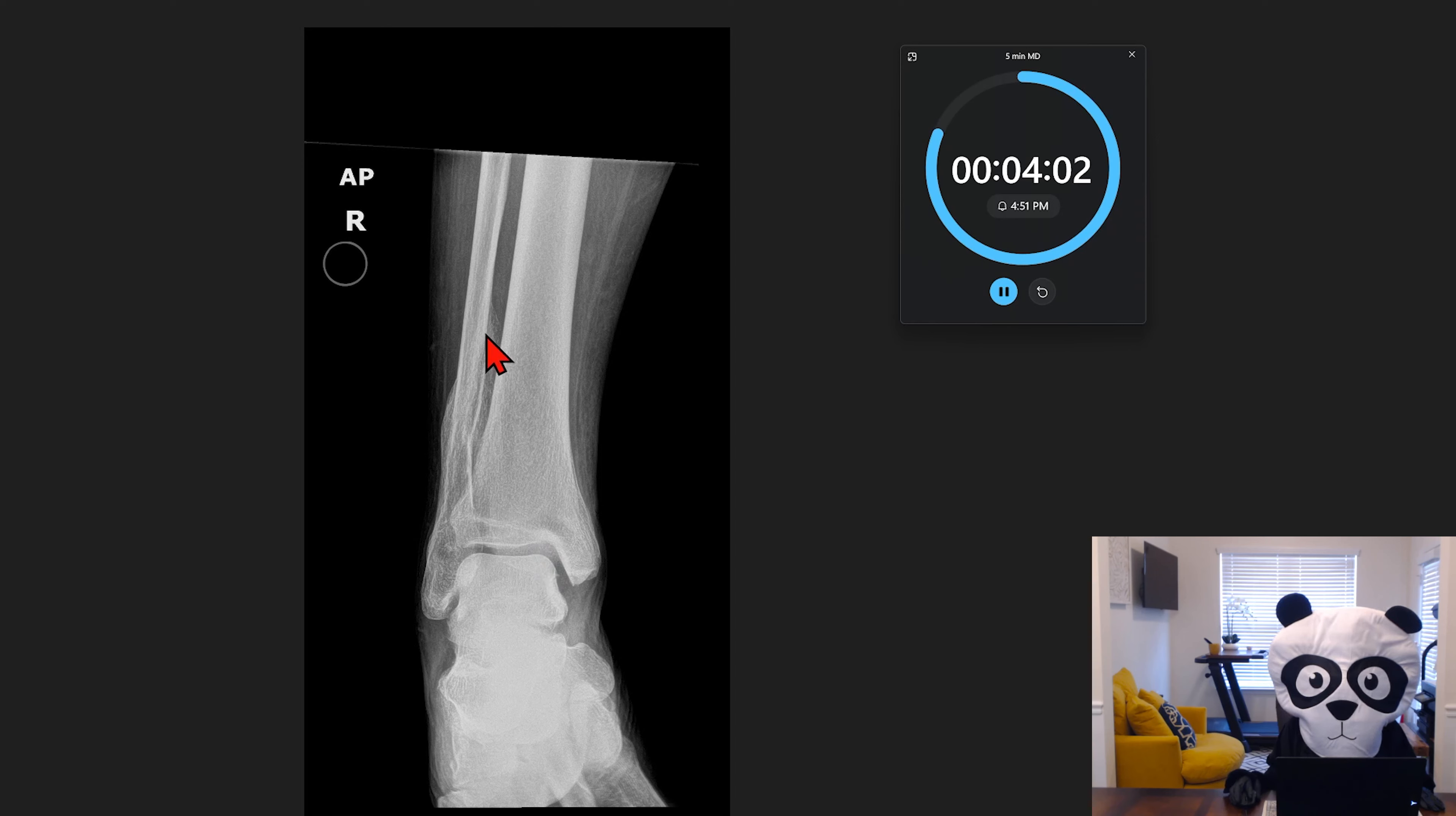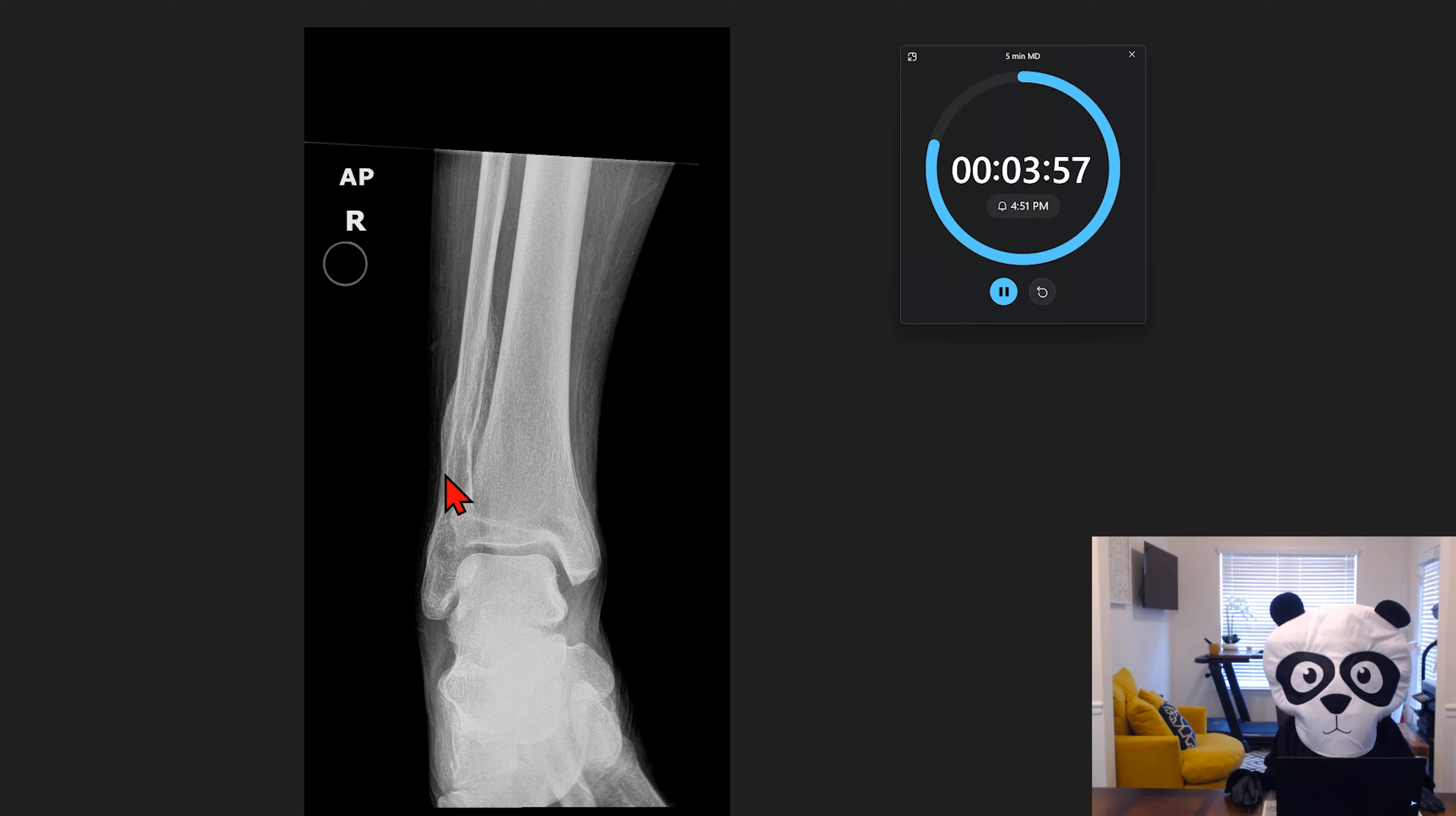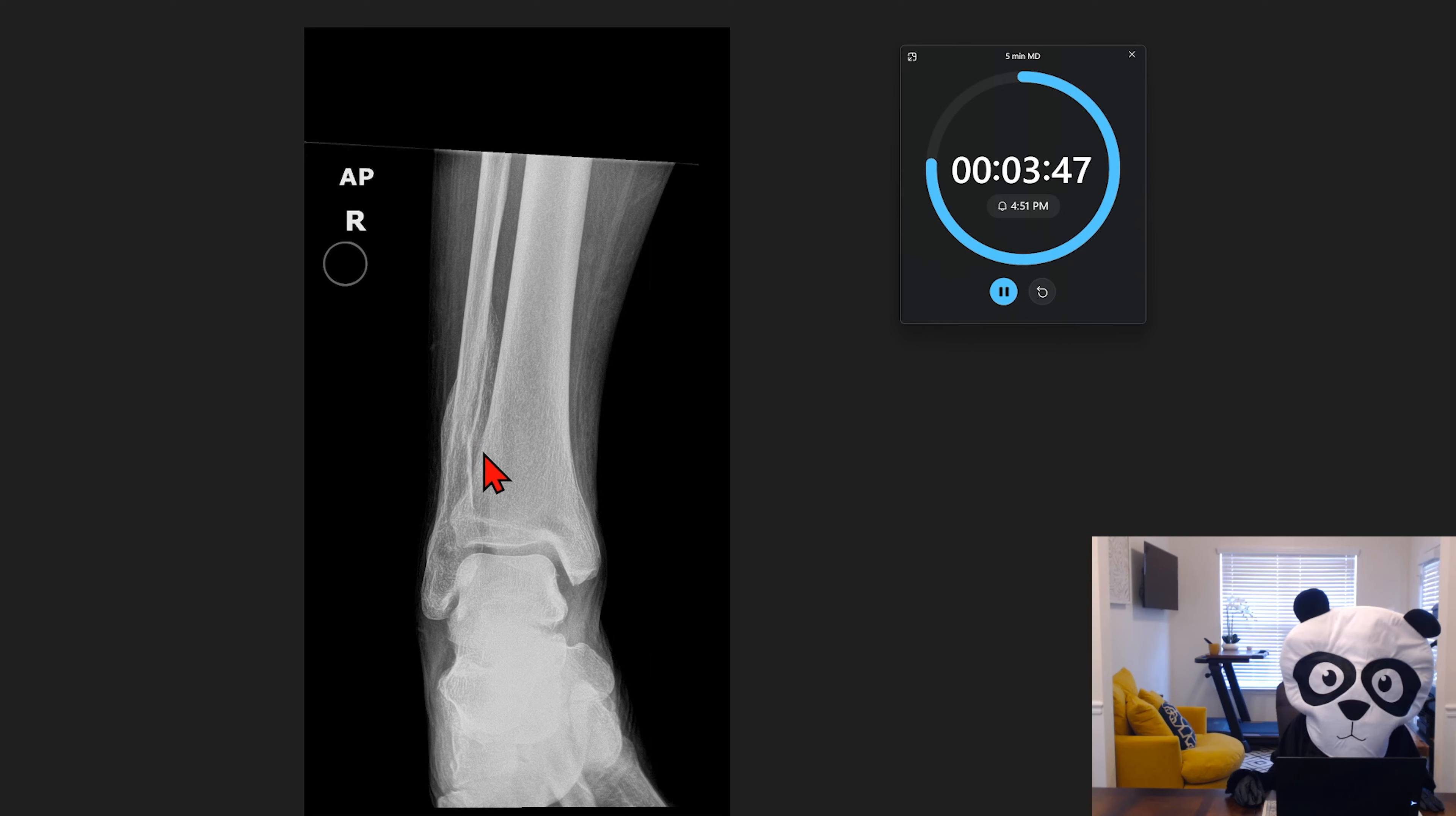However, we do see this chronic deformity involving the distal fibular shaft. We can tell that it's chronic because if we look, there's callus formation and some osseous bridging, which means that this is a remote trauma that occurred sometime in the past and has subsequently healed.